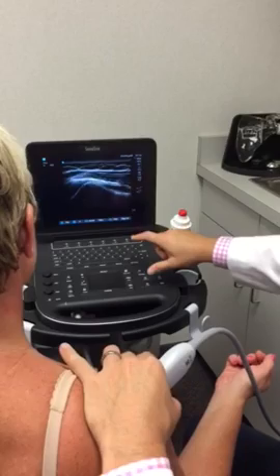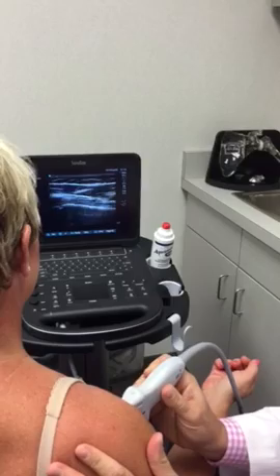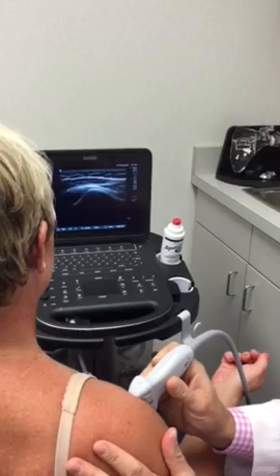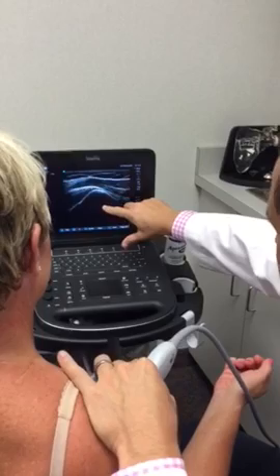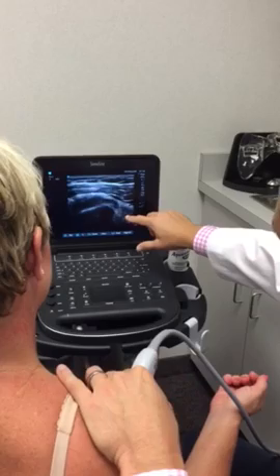Medial here is the lesser tuberosity, so if you go back and forth you see two mountains, and in between them is always going to be the biceps tendon. We look at our biceps tendon in the long axis, come down distal, and get it in plane. Then moving medial, here's the lesser tuberosity, and just medial to this is the subscapularis muscle belly looking at it on the short axis.